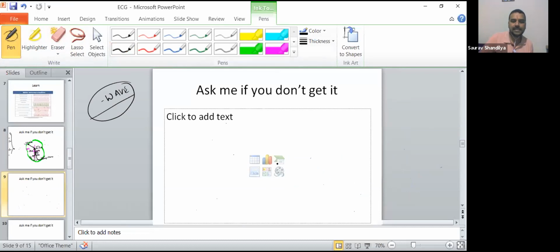S wave, if you see it in any ECG paper, I'm showing you from the side. P wave, PR interval. Okay, go to the Q, then R, S wave, ST, and T wave. So this S wave, why does it go downward? Let us talk about it.